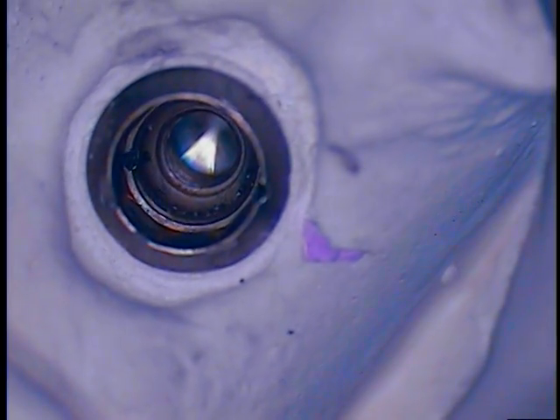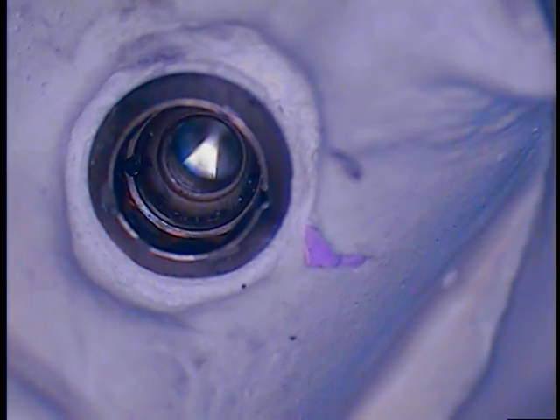I'm here with a Strähmann Tissue Level Solid Abutment case, and what you're seeing right now is my mock-up trial removal of the frozen solid abutment that is now within the patient's mouth.